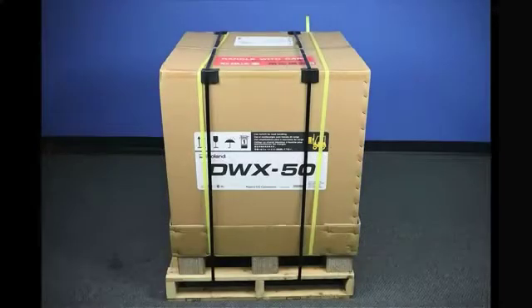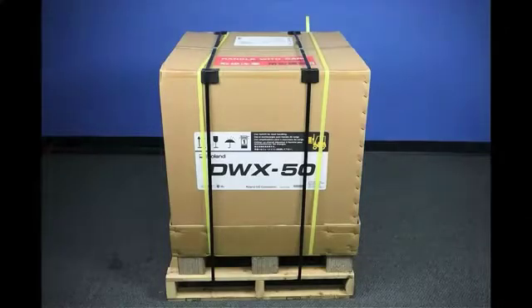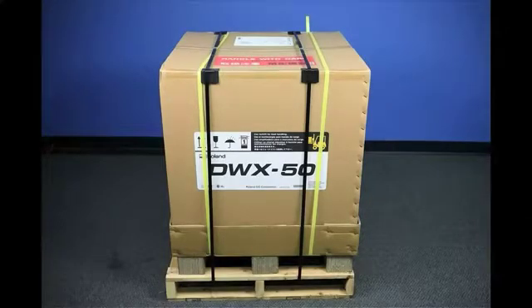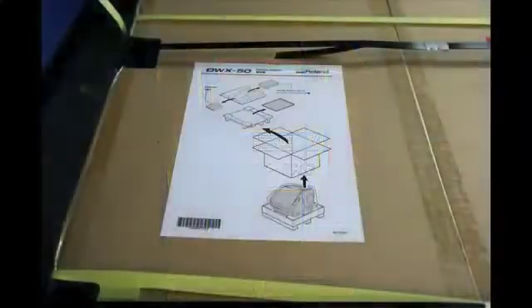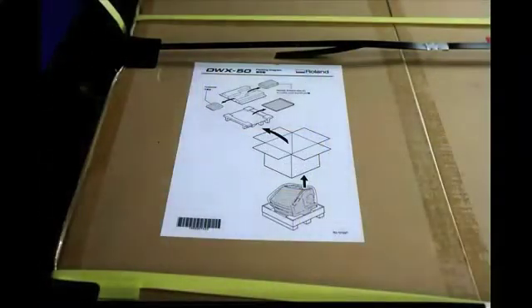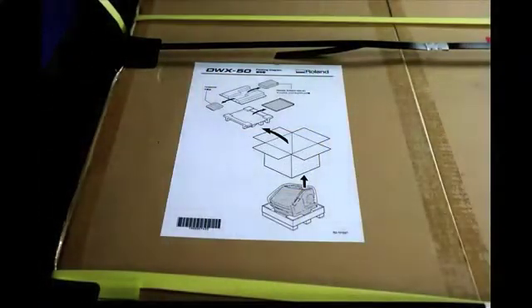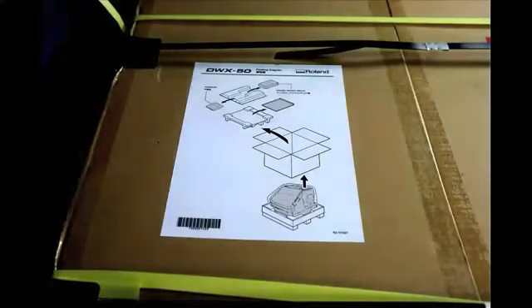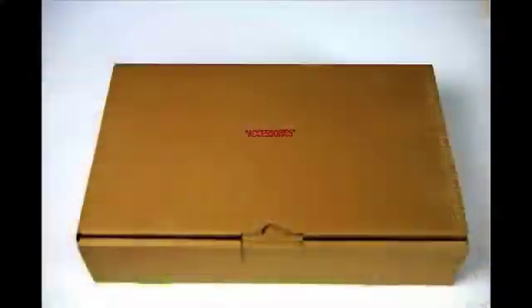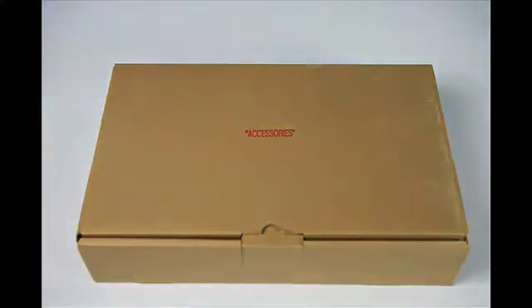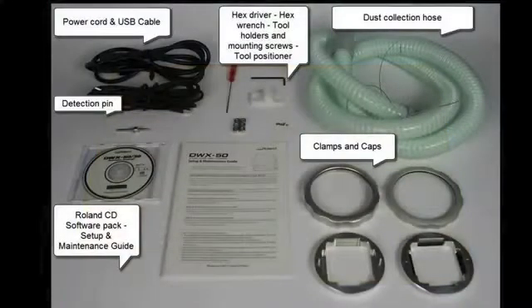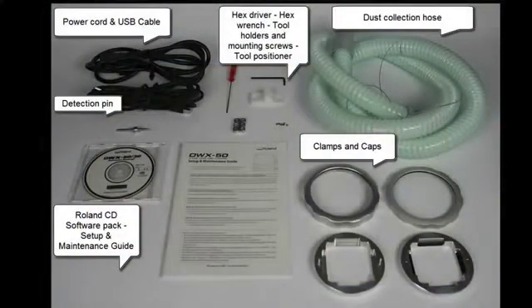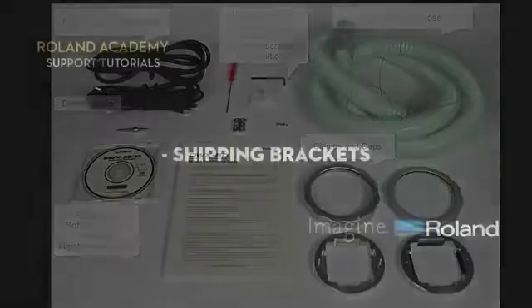This tutorial video will assist you in the setup and installation of your Roland DWX 50 dental milling machine. After unpacking the machine by following the instructions located on the box, you'll need to find your accessories kit. In the box you will locate the accessories which will assist you in your completion of the setup process.